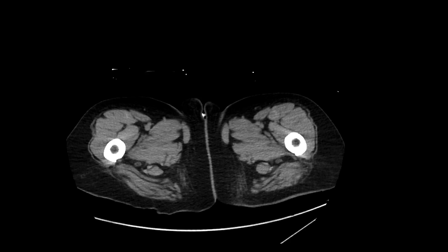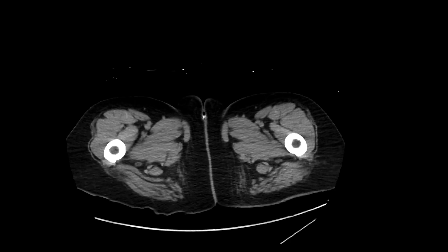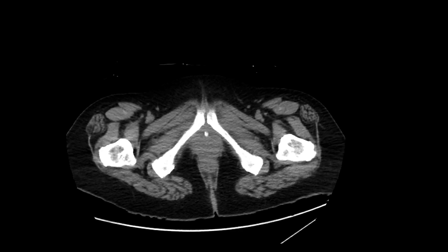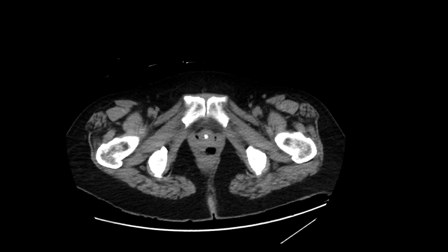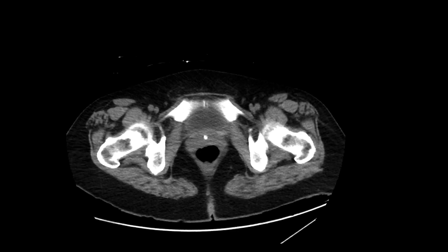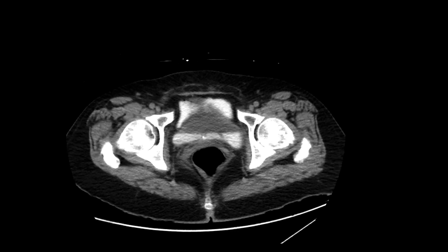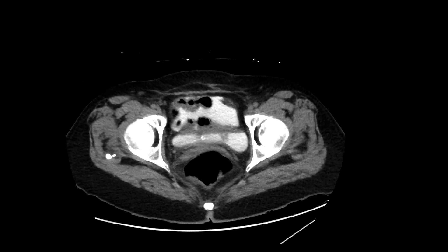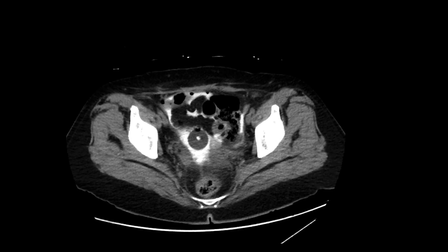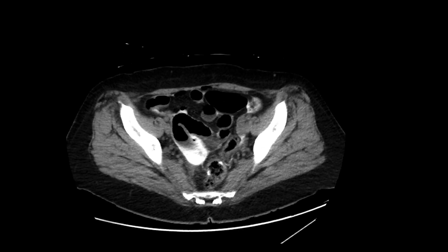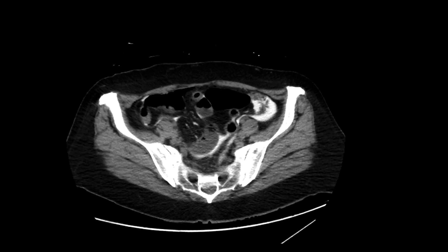This is a patient who comes in with suspected bladder injury, for which we ended up doing a CT cystogram. You can see there's a Foley catheter over here. We've injected contrast through the Foley catheter, and clearly we can start to see that there's contrast within the pelvis over here.